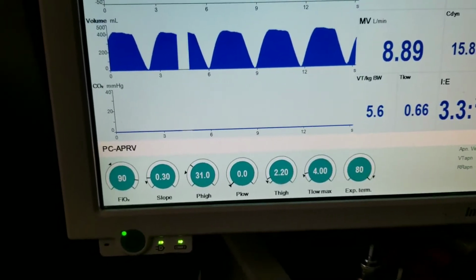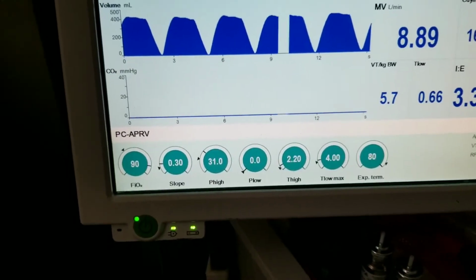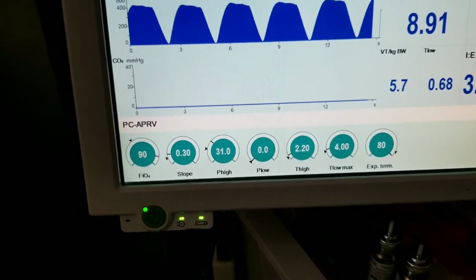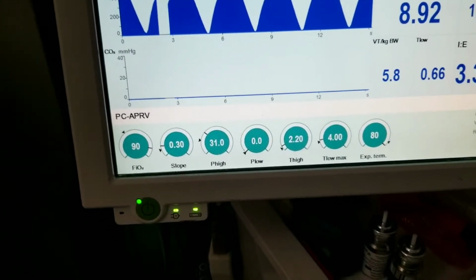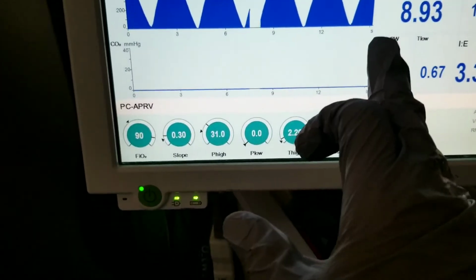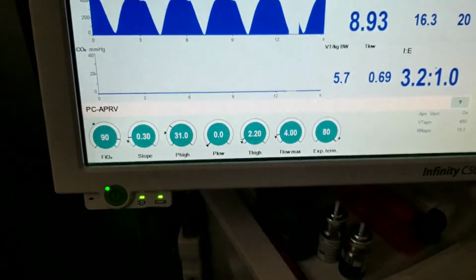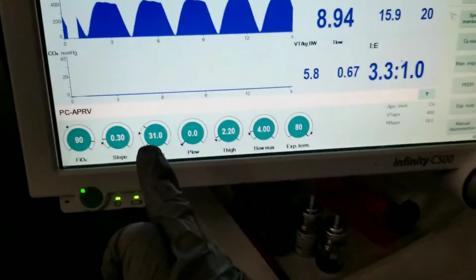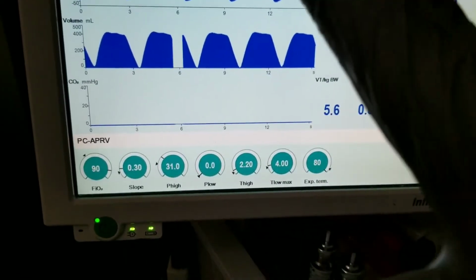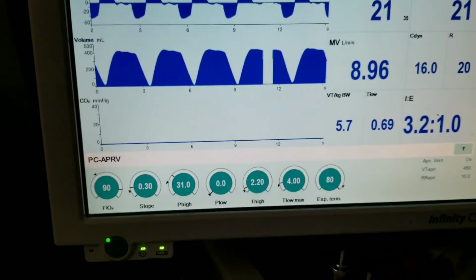Don't forget, in part 1 we spoke about it being a patient with morbid obesity, and definitely a long-term ventilated patient. She's lost a lot of weight over the last 4 weeks. So it just makes sense that I was confident to put it at 34 initially, because I knew that there was a lot of pressure from the weight pushing down on the lung. So I wasn't worried that the 34 was all being distributed to the inside of the lung. I knew that there was also a lot of pressure pushing down on the chest from the obesity. Lost a lot of weight.